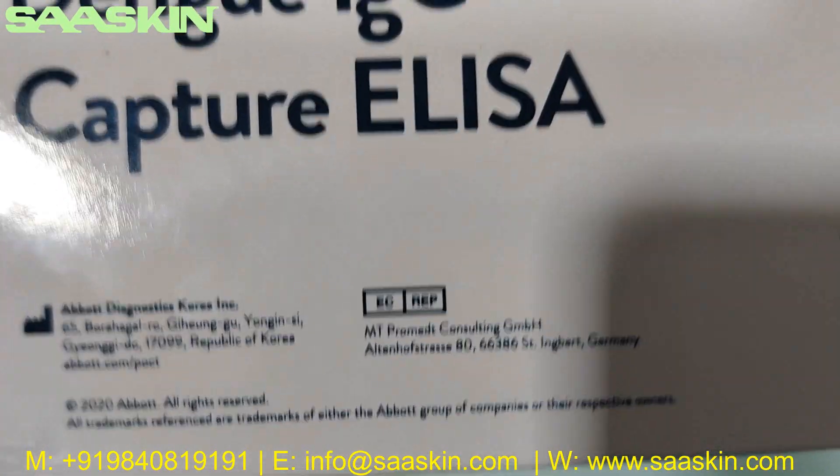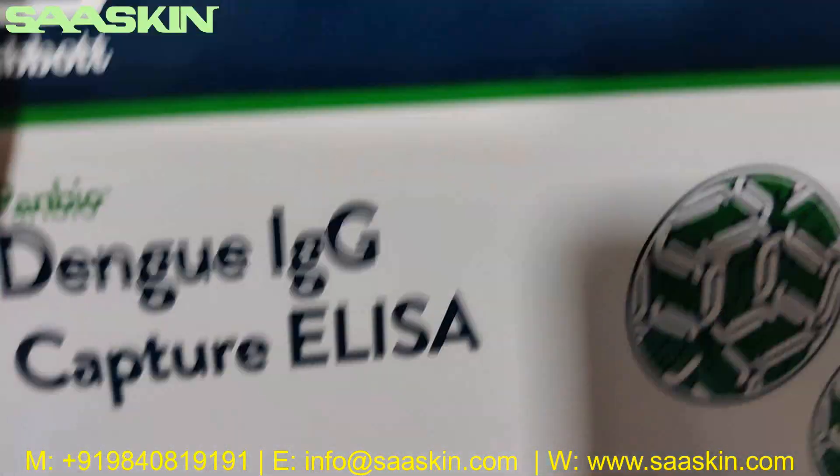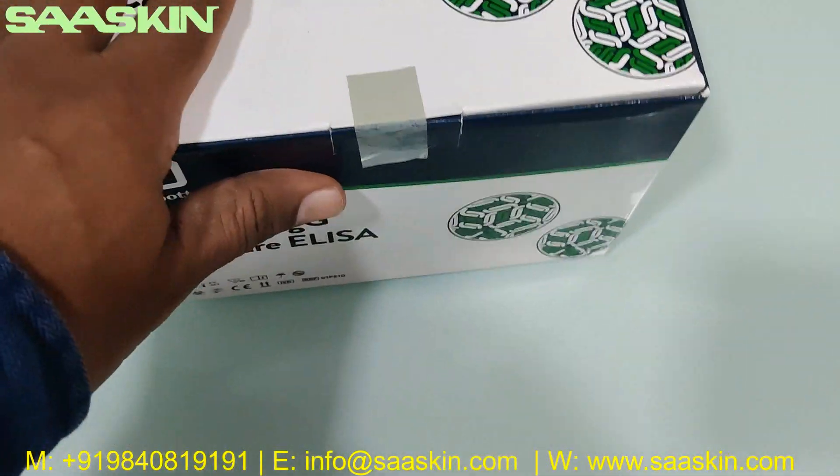This is from the Abbott code here. You can see this part number reference. Let me unbox this for you.